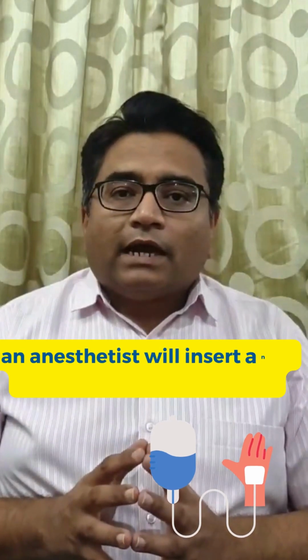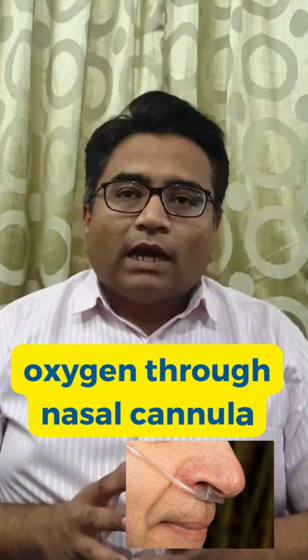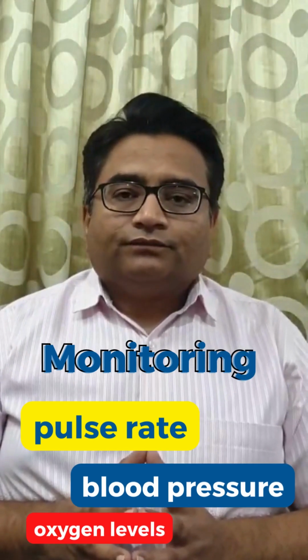Then the anesthetist will insert an IV cannula on your right hand and administer certain drugs. You will be given oxygen through a nasal cannula, and there will be vital monitoring of your temperature, pulse rate, blood pressure and oxygen levels.